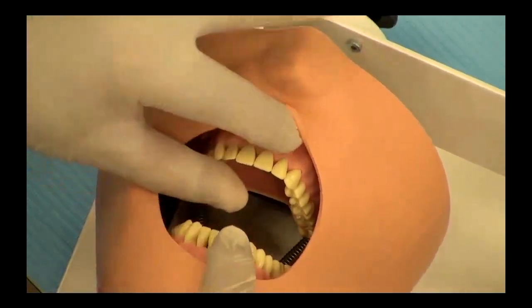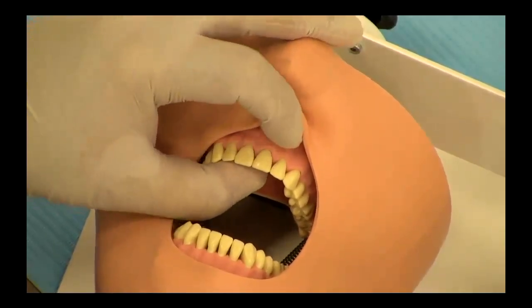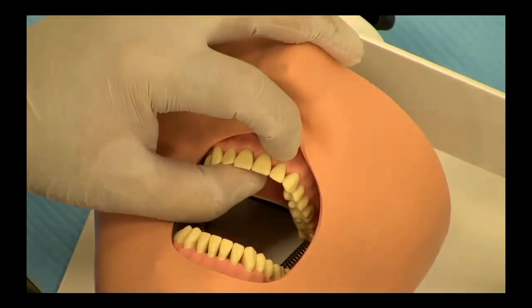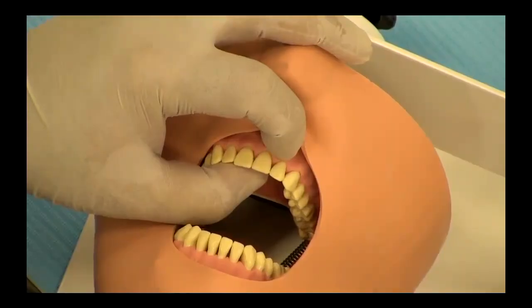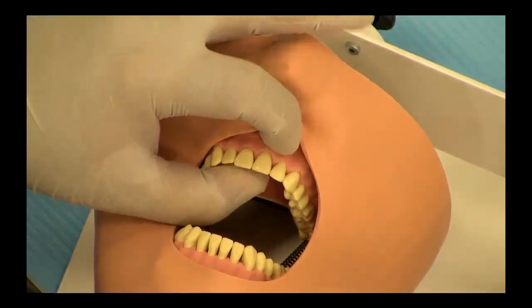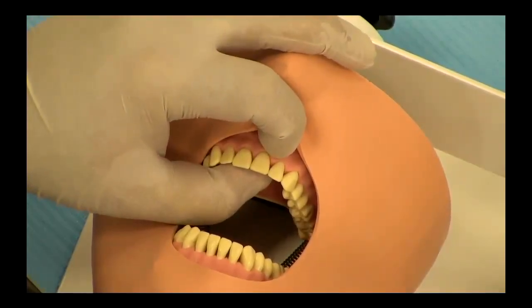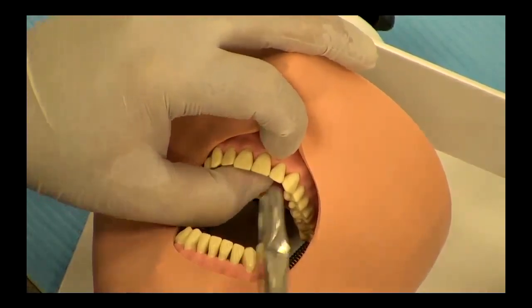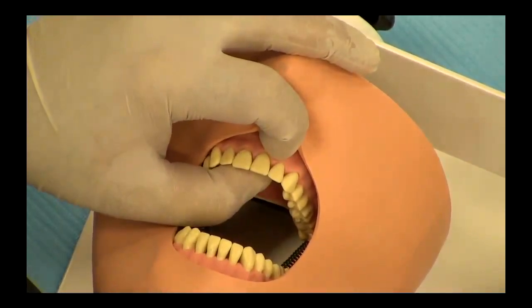So for the maxillary anterior segment, you will keep your forefinger on the labial side and the thumb on the palate, and you can then apply your forceps, and that's for the maxillary anterior segment.